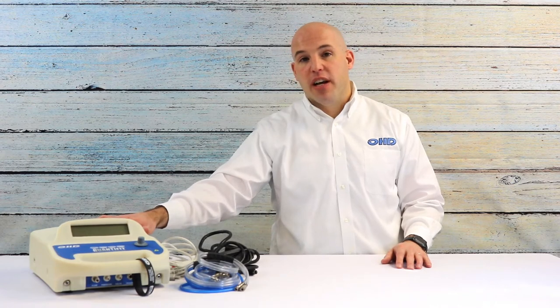Hey everyone, my name is Booth Armstrong and I work for OHD. I'm excited about providing a quick start training video for you on the OHD Quantifit respiratory mask fit testing device. Today we're going to paint with a broad stroke, but I'm eager that this video would help you launch out in your endeavor of doing your fit testing.